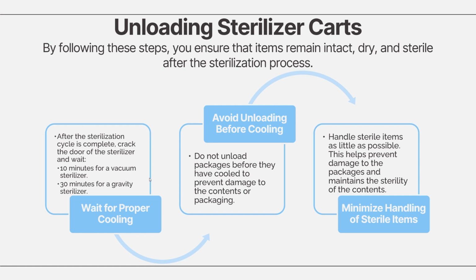So I'll get more into detail about vacuum and gravity sterilizers next week, I believe. So the cooling period is essential because packages and instruments inside are still extremely hot and under pressure. Opening too soon can cause condensation or sudden temperature changes, which leads to moisture buildup inside packages. So you have to avoid unloading before having allowed items to cool thoroughly. Unloading while still hot increases the risk of compromising integrity of the packaging.